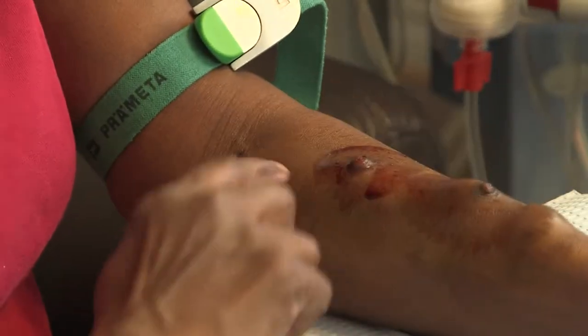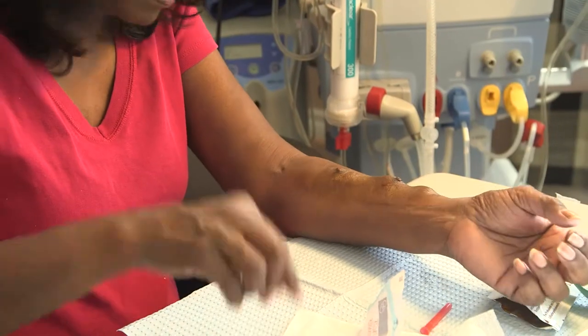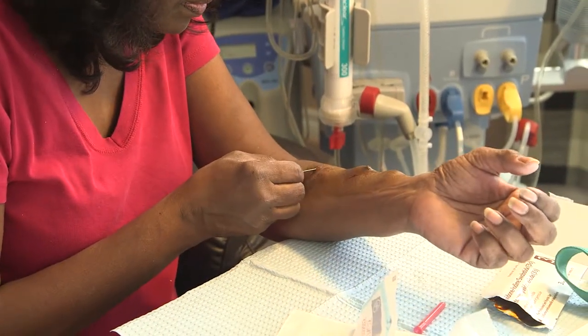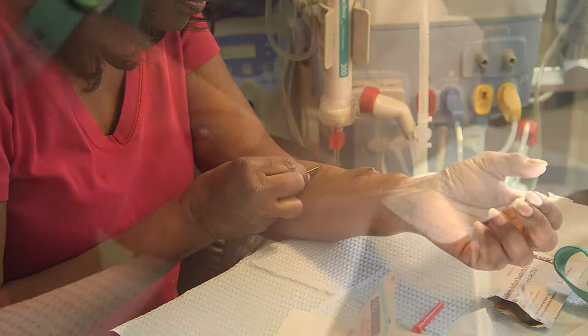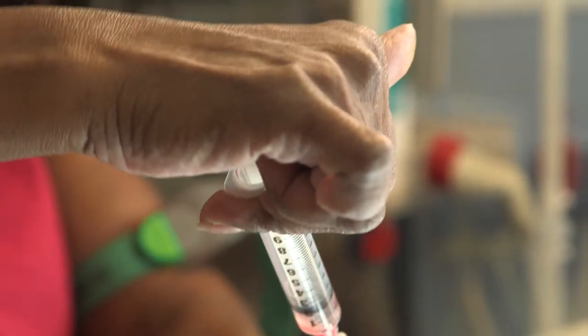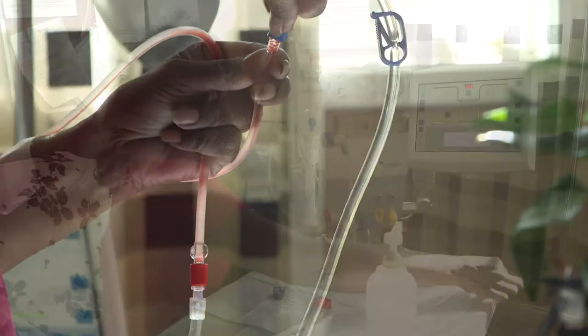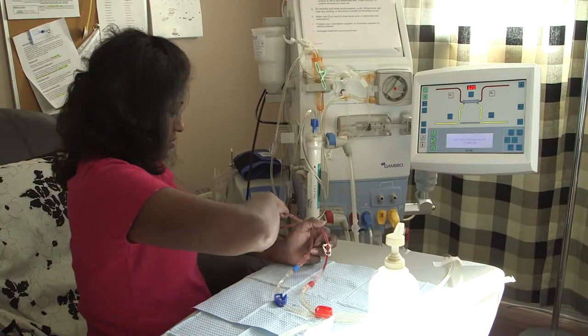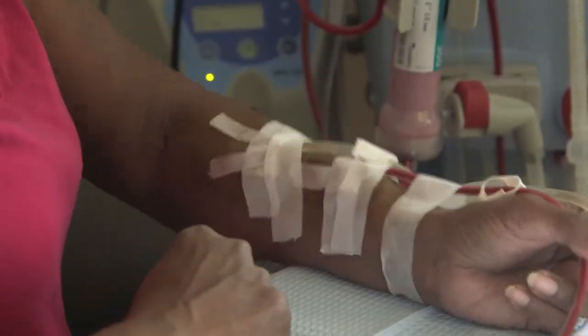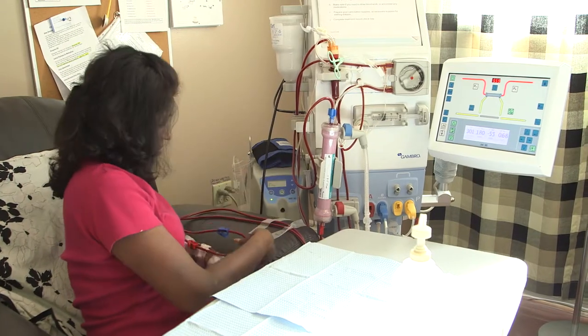The patient applies a disinfectant to the fistula and allows it to dry completely prior to insertion of the catheters, also known as needling. They then carefully remove any previous scabbing to allow entry of the catheter needles. Each catheter is carefully inserted, secured, and flushed with saline solution. Both are clamped off prior to the exchange, then connected to the machine and clamps removed. All lines are secured and the access arm is comfortably positioned.